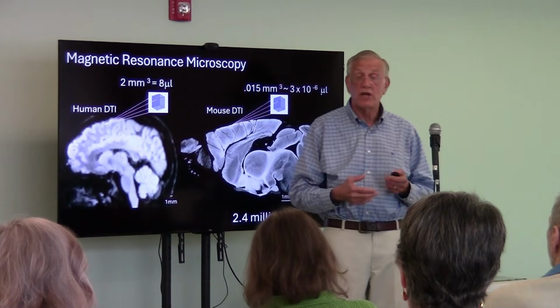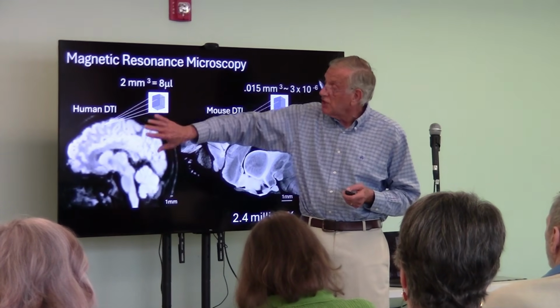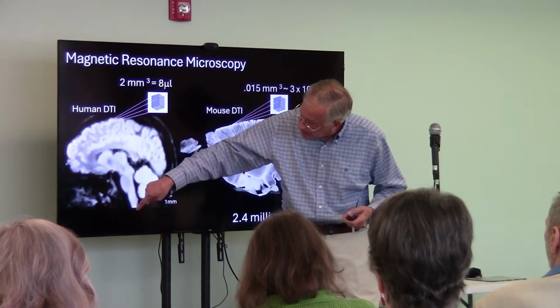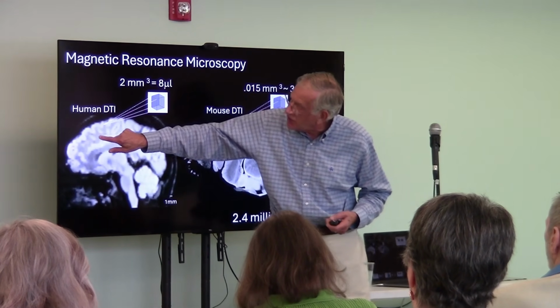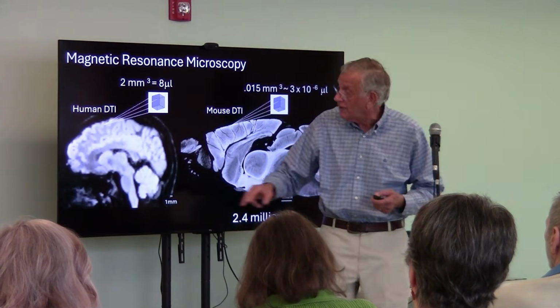Typical MR scans of the head will be 1 by 1 by 1 millimeter. But these are 8 times worse, but you are getting this contrast. So here's some detail. This is the brain stem here going down into the spinal cord. This is the cerebellum. You can see some differentiation between gray and white matter here. It'll get much better once we start doing the math.